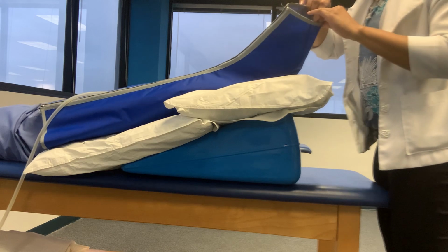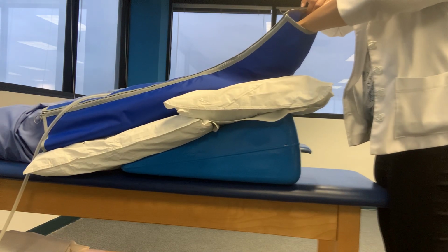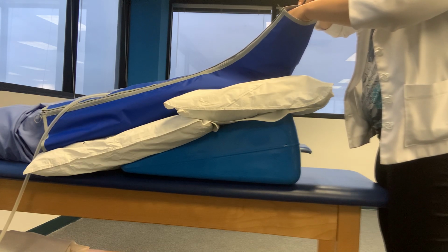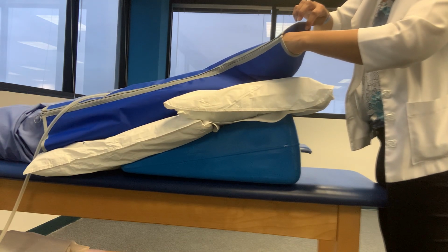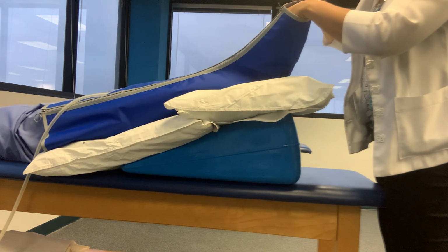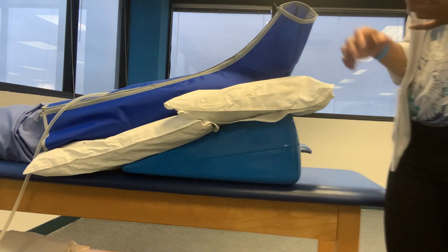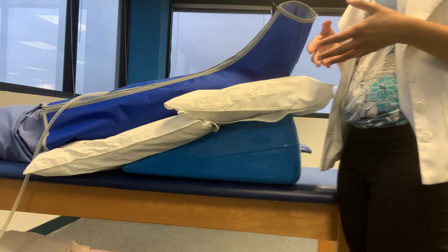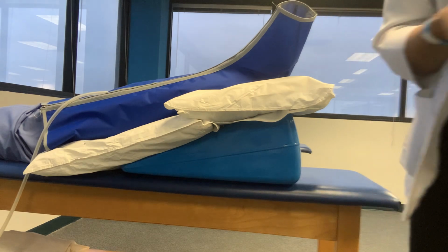And then what I'm going to do is I'm going to open the sleeve. I'm not going to open the sleeve. I'm going to stick my hand in the sleeve. I'm going to separate the stockinette and just ask my patient to wiggle their toes. So that's all I'm doing, right? Just asking them to wiggle your toes. So can you wiggle your toes? Okay. So as long as they can wiggle their toes comfortably and they respond that the amount of compression that they're getting is okay, then I know that they can tolerate that pressure.